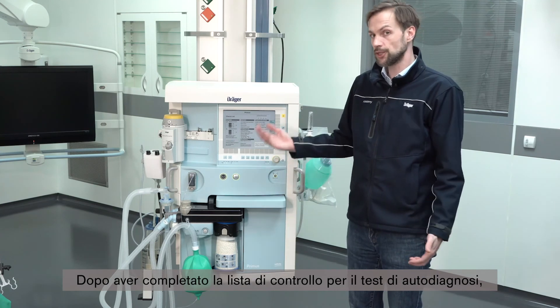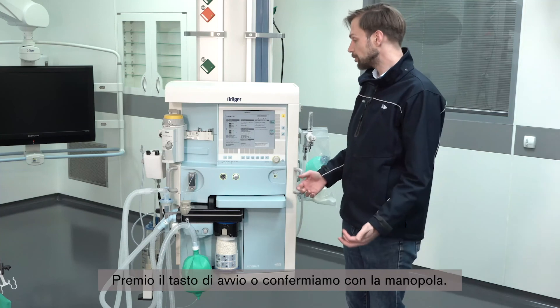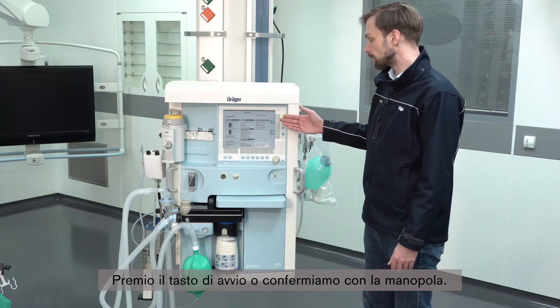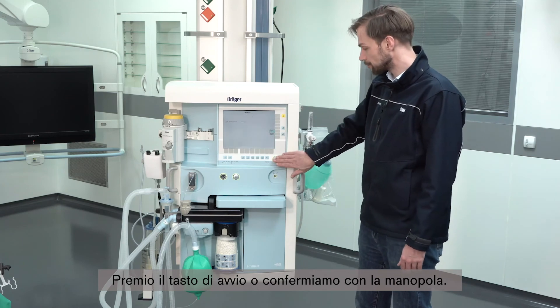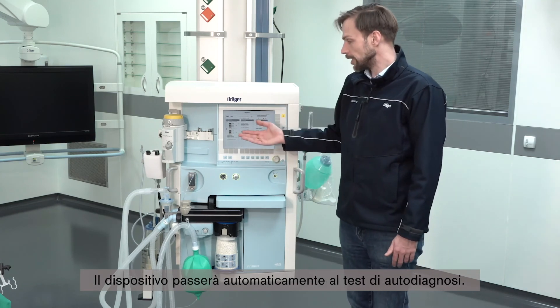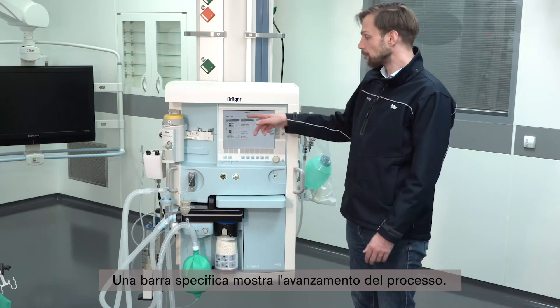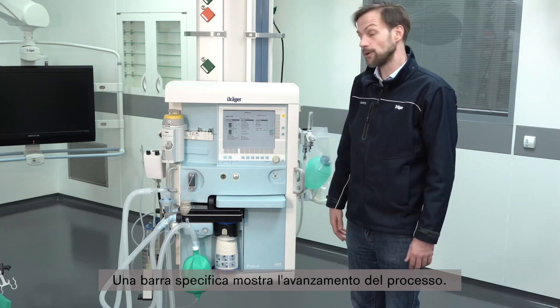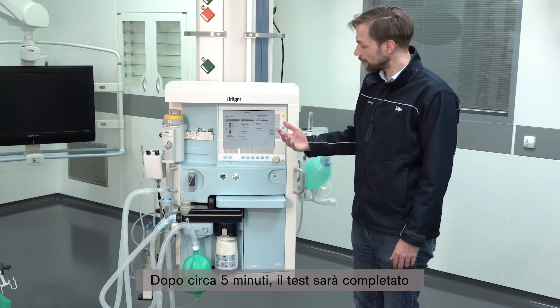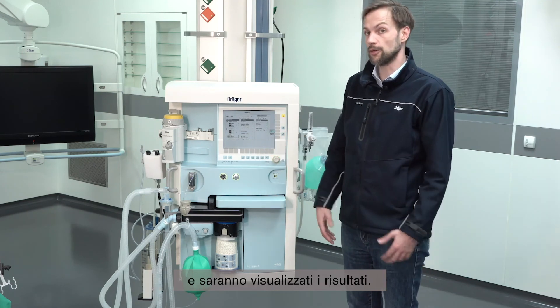After going through the checklist for the self-test, we can now start the self-test by pressing the start self-test button or by pressing the rotary knob. The device will now automatically go through the self-test. The progress bar will show how far it is in the process, and after roughly five minutes it will be done and will show us the result.